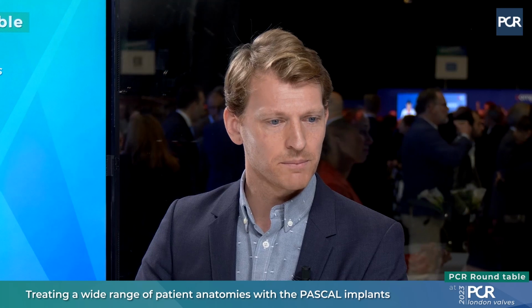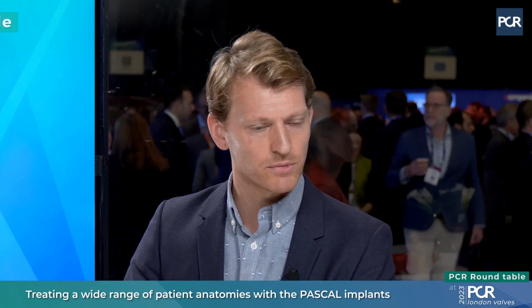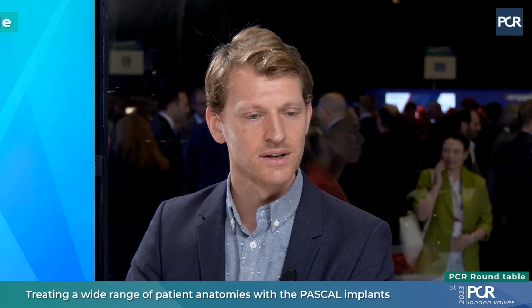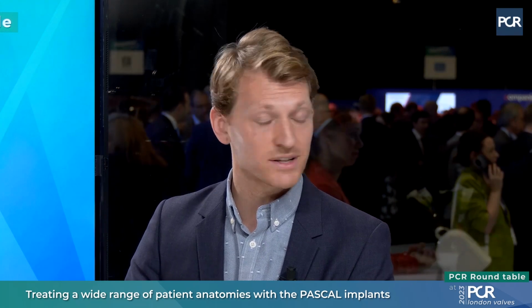In terms of the published data recommendation from Jörg Hausschleiter, I would maybe not agree with the smaller valve area, which for me is more a P10 go-to situation, because I like to use the spacer in cases where we have maybe issues with the borderline gradient, but otherwise I definitely think we have devices to treat multiple anatomies. What do you think, Sam?